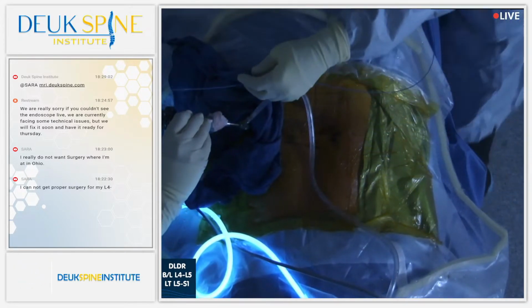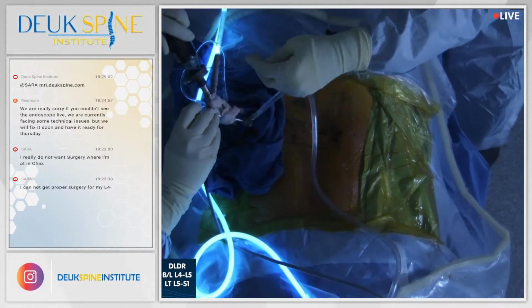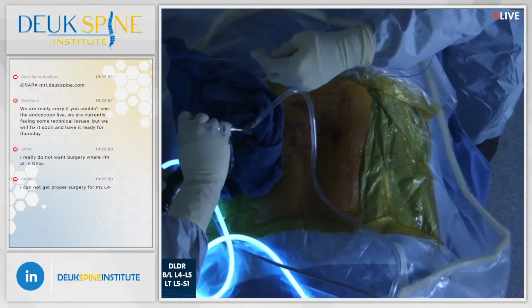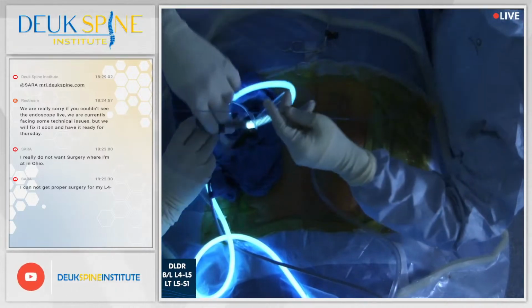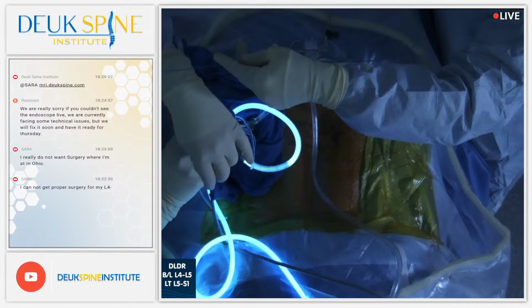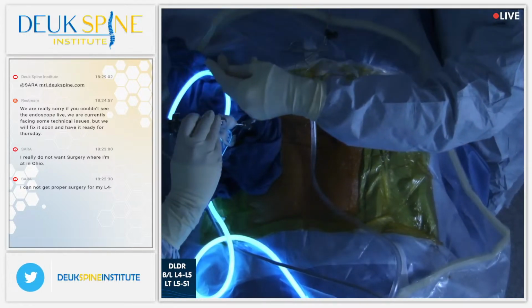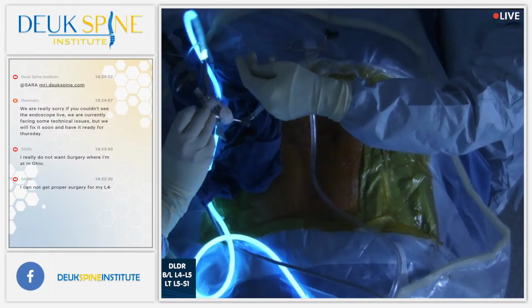Looks like we mangled the plastic on the end. See that? Luis? Look at the plastic. Oh, yeah. What happened? It's okay, I'm sure. Oh, it's burned, yeah. How did that happen? Weird. It's unusual.